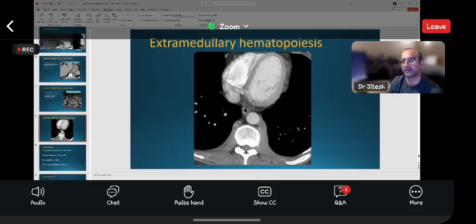So it's not easy to differentiate based on imaging, but the patient's age can help to differentiate non-fat containing germ cell tumors from thymic carcinomas. And then the second point is that if we have tumor markers, beta HCG, AFP, or LDH, those can help to narrow the differential.